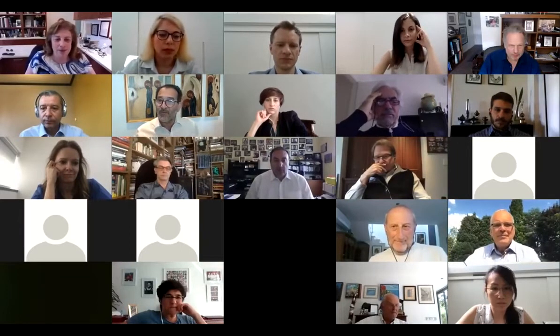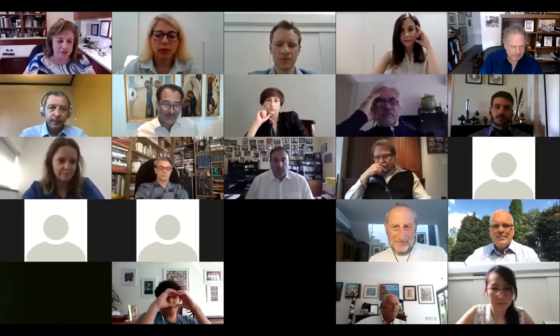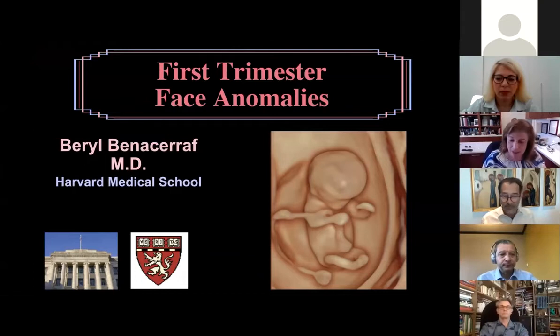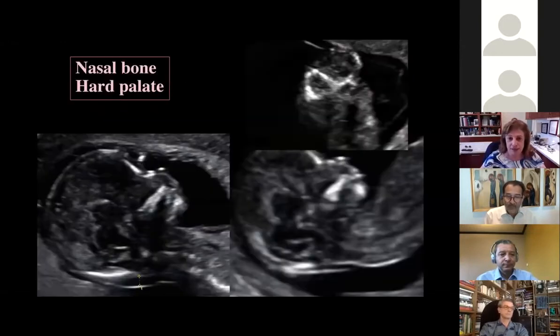I'm thrilled to be part of this incredibly great group of people. And I was asked to spend 15 minutes talking about first trimester anomalies. I don't think I can do that in 15 minutes. And so I narrowed it down to choose anomalies of the face, which really reflects a lot of syndromes that we talk about that seem to have findings related to the fetal face.